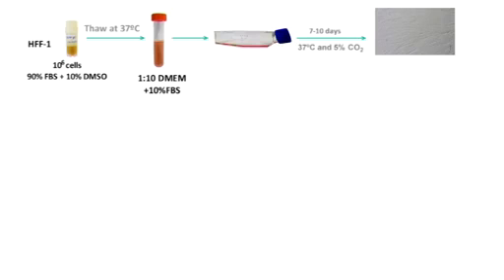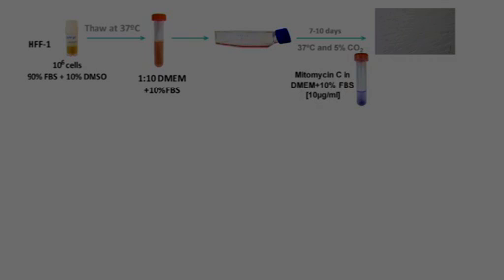Next, to inactivate the fibroblasts, dilute mitomycin C in DMEM supplemented with fetal bovine serum and incubate the cells for 3 hours.